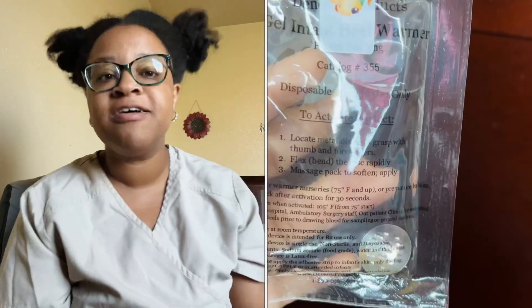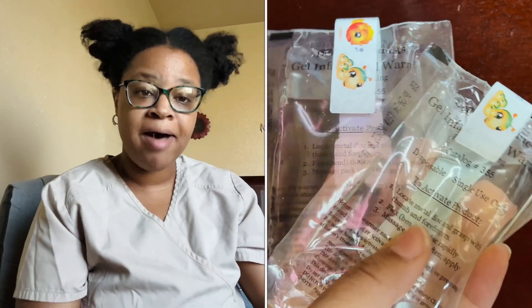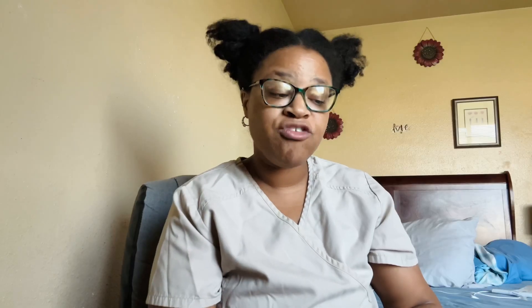Since this is a capillary blood draw, we're not looking for veins, but it is crucial for the body to be warmed up before sticking it with a needle — it can give an adequate amount of good blood flow. Heel warmers look different from different companies. Mine look like a liquidy solution with a little metal disc inside, and instructions are printed on the front of the heel warmer.